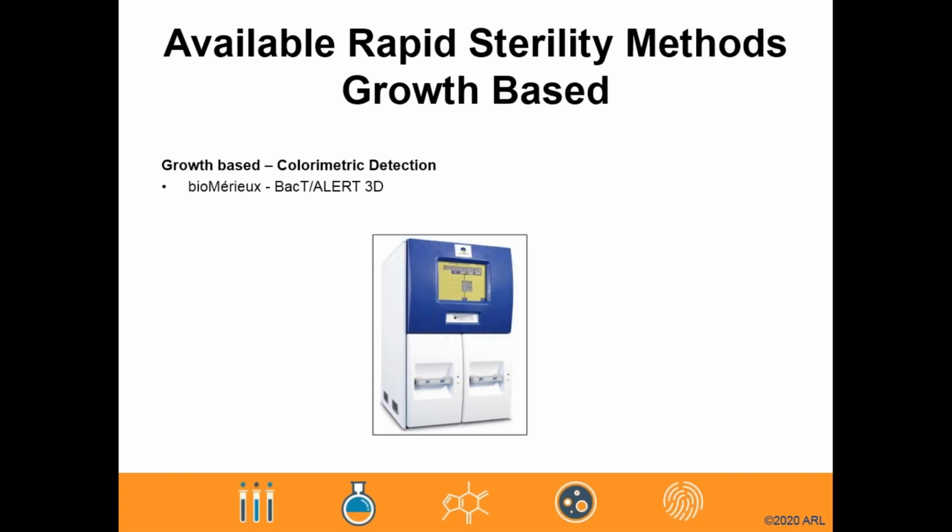During certain microbial growth, CO2 in a closed container accumulates and diffuses into the colorimetric sensor at the base of the bottle. Specifically, hydrogen ions interact with the sensor, resulting in a decrease in pH, causing the sensor to change to a yellowish color. One notable benefit with this system is that it automatically monitors all samples and all sensors every 10 minutes, which provides very up-to-date test data.